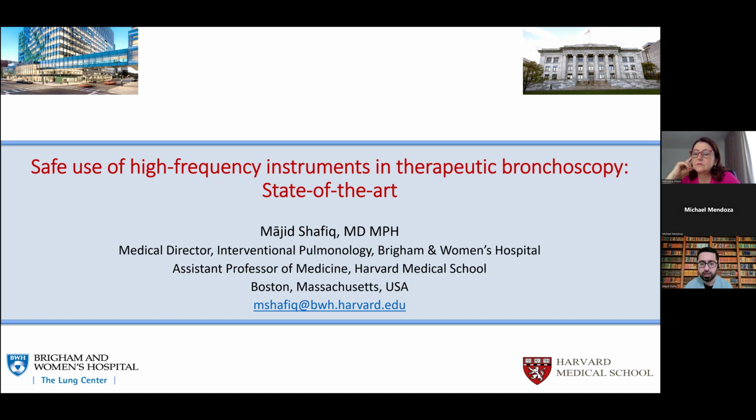And secondly, safety-wise, you want to make sure that the cryoprobe with the lesion or the tissue that you've gotten, and we do veer a little bit away from the therapeutic bronchoscopy, but I'm loving the questions. Thank you for asking all these questions. So I know that is diagnostic, not therapeutic bronchoscopy, but nonetheless, you want to make sure that the tissue that you just acquired is also safe and doesn't get hung up on the cords, doesn't injure the cords. The cryoprobe that you might still be potentially pressing the pedal on is not touching the cords. Next thing you know, heaven forbid, you're freezing the cord and trying to yank it out, right? So I would absolutely use the rigid between those two, and I would not expose the vocal cords.